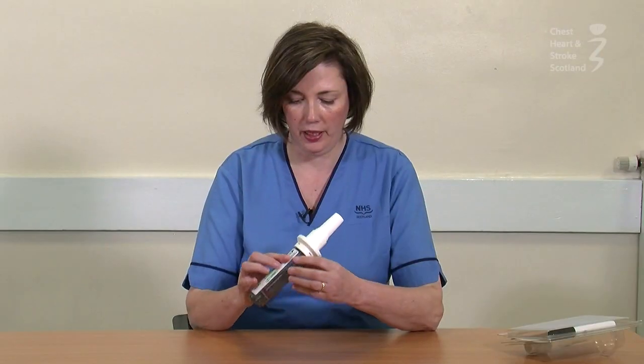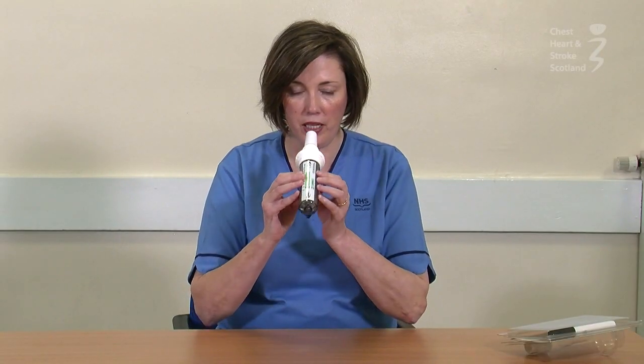Pop a one-way valve in, hand it to the patient and get them to breathe in, like so.